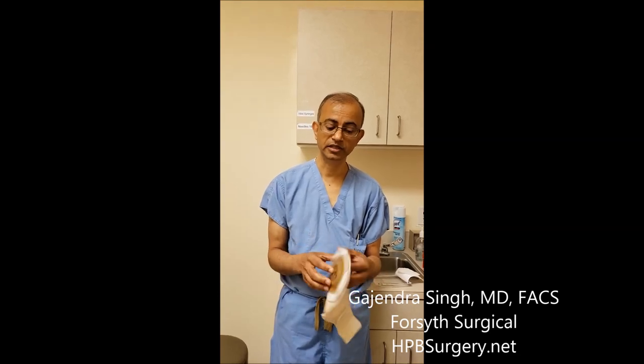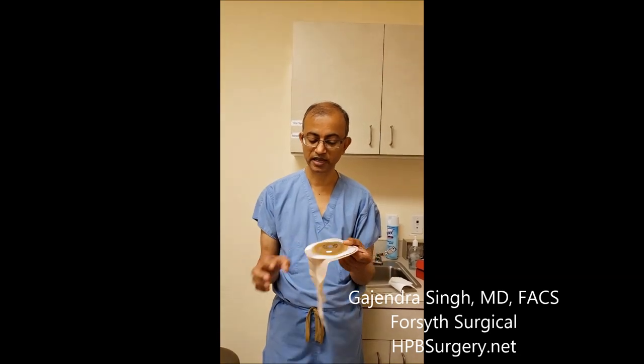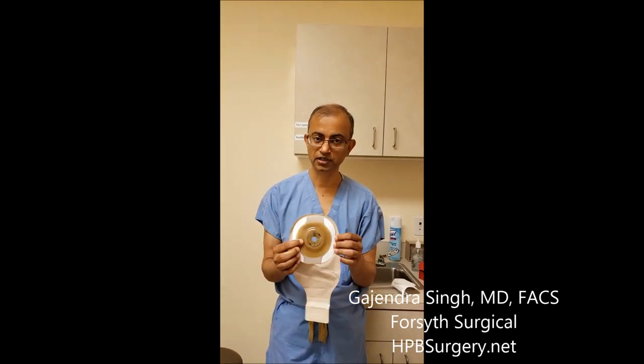Hey guys, this is Dr. Singh. We get a lot of questions from patients who have a colostomy or ileostomy about how to change the bag. This is a colostomy bag — one of the Hollister bags, a single-piece bag. It's got a soft convex backing and a sticky side.